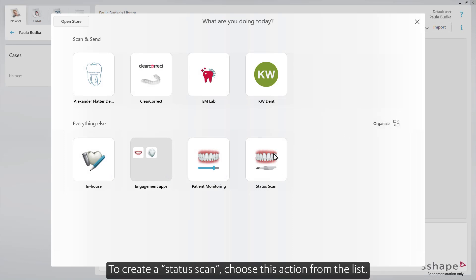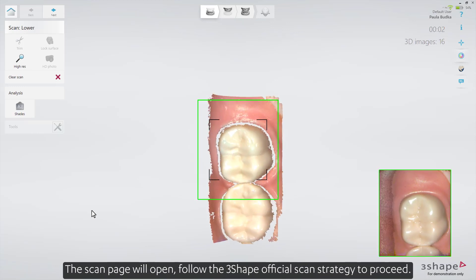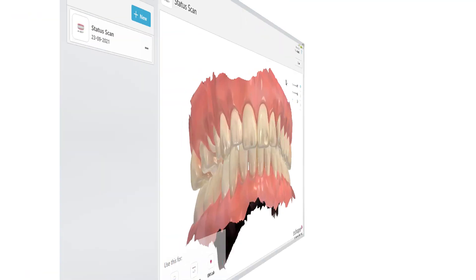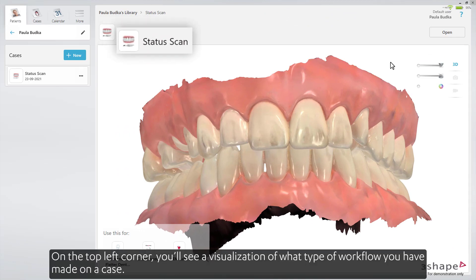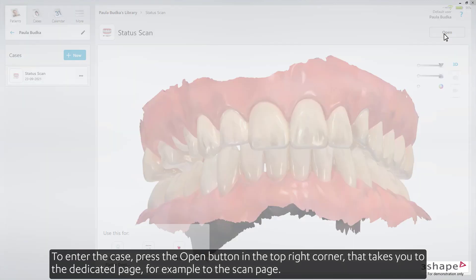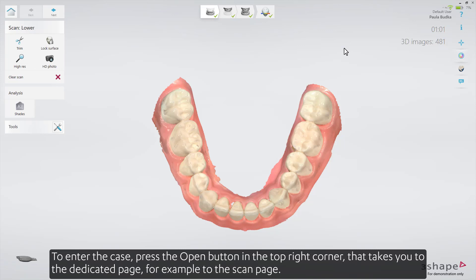To create a status scan, choose this action from the list. The scan page will open. Follow the 3Shape official scan strategy to proceed. After the case has been created, you can view it in the case preview. On the top left corner, you'll see a visualization of what type of workflow you have made on a case. To enter the case, press the Open button in the top right corner. That takes you to the dedicated page, for example, to the scan page.